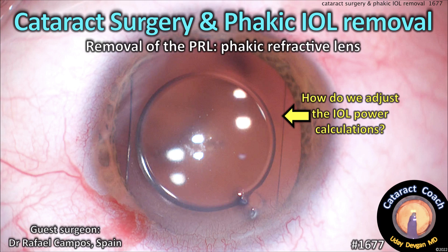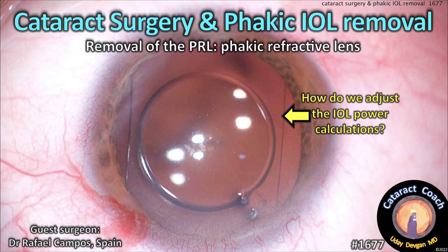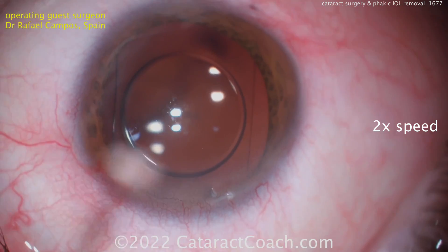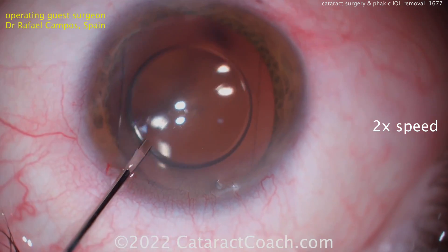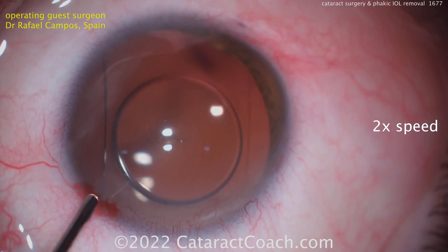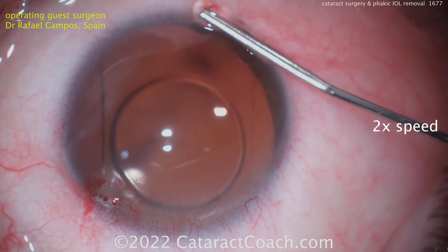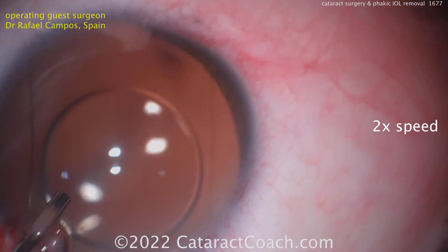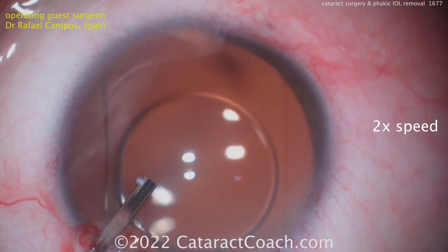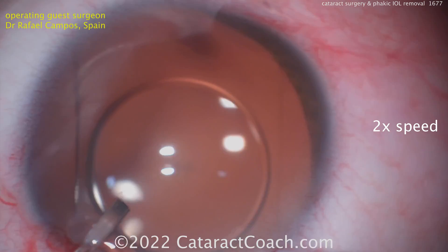CataractCoach.com — Cataract Surgery and Phakic IOL Removal. This is the removal of the PRL, the Phakic Refractive Lens. We've shown you videos in the past for removal of the ICL. This is the PRL, a different brand name of lens that was used many years ago. It's a minus power lens used to treat myopia, placed in the sulcus in front of the human crystalline lens.